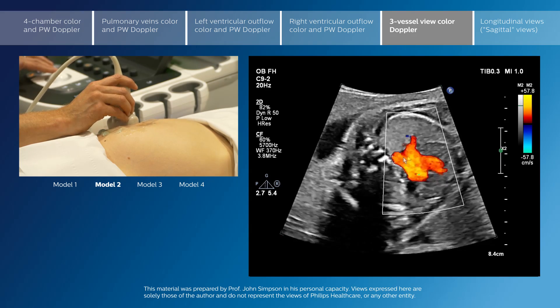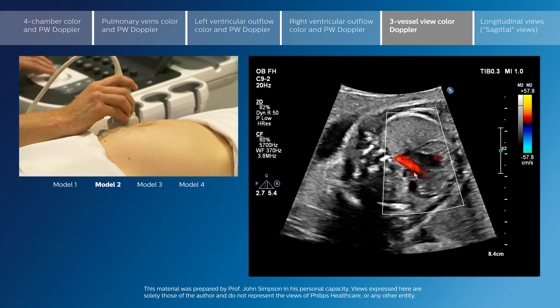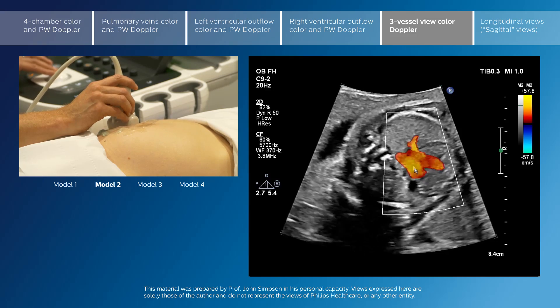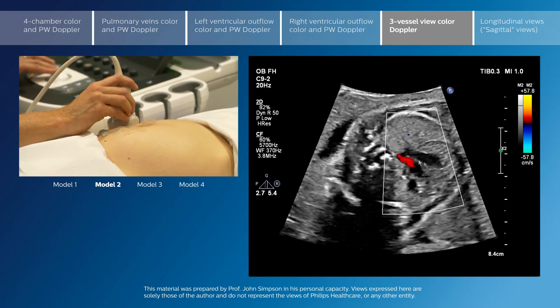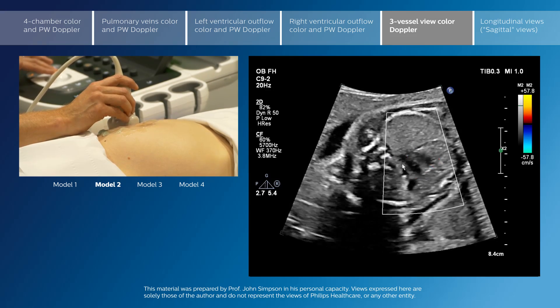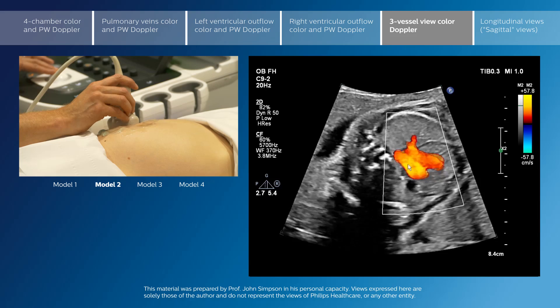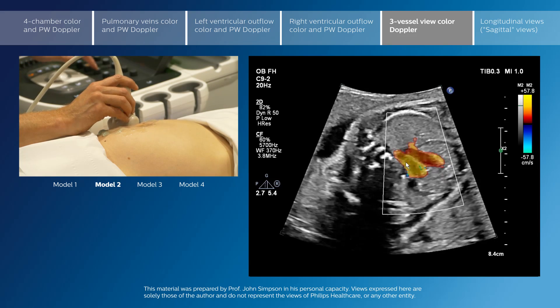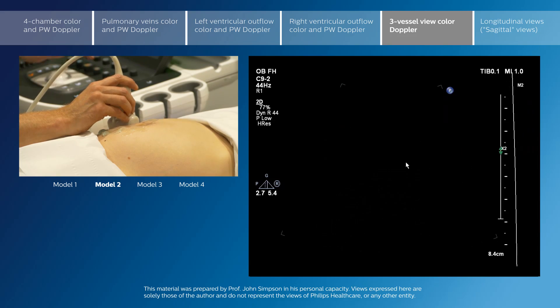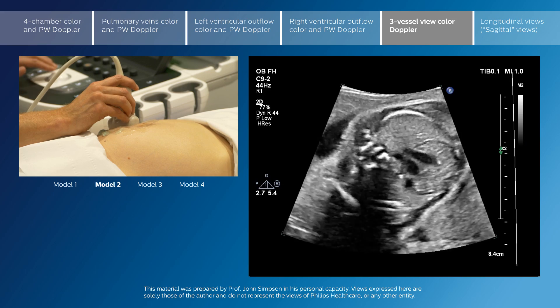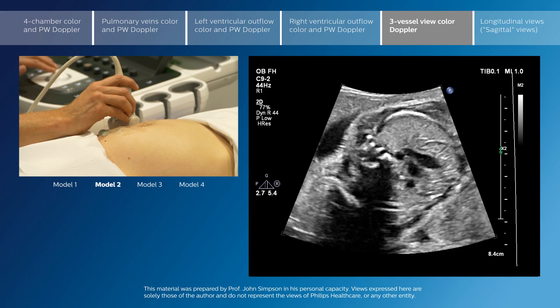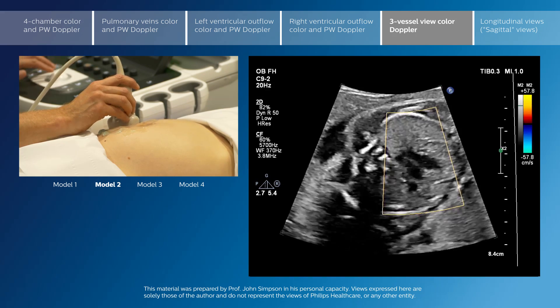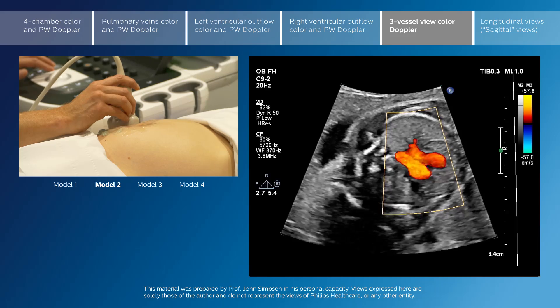These arteries should have the same color flow — the flow should be going in the same direction. Any major asymmetry in the size of the vessels, or a difference in their color flow direction, can indicate an underlying cardiac defect.